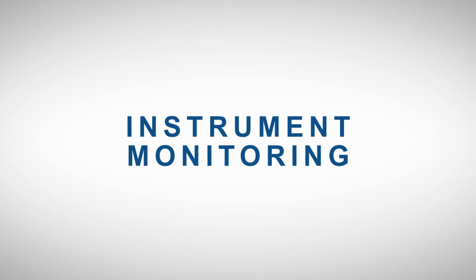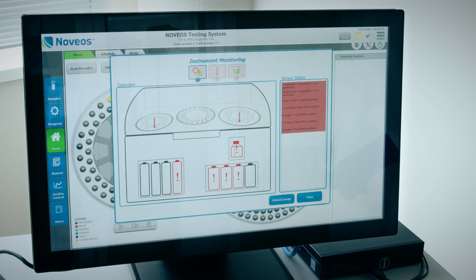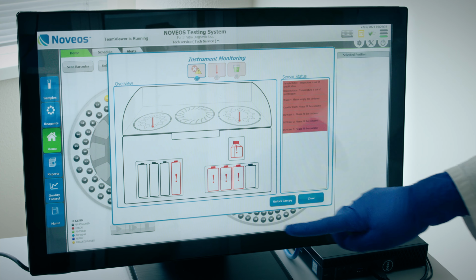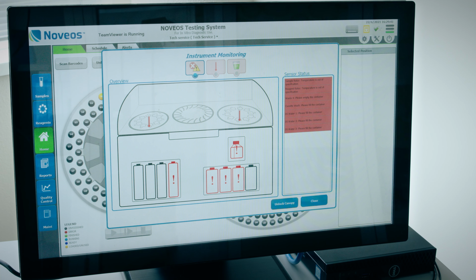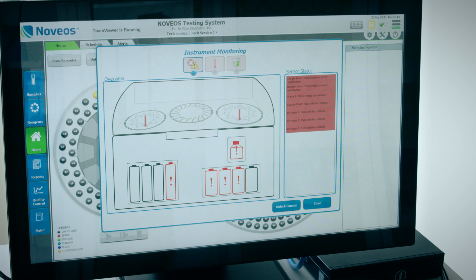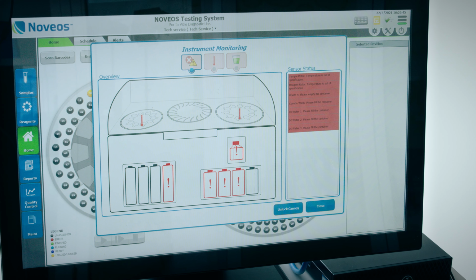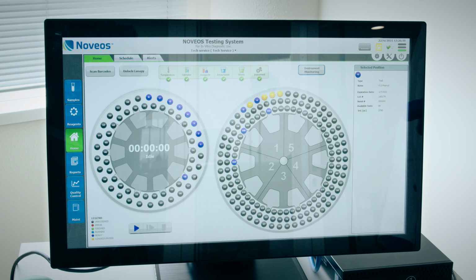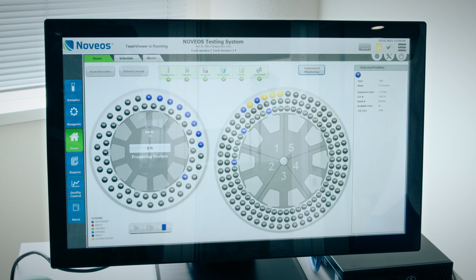Instrument monitoring. Briefly, we can see the upper and lower deck as well as the sensor status. Just like on the instrument itself, it shows the waste container on the left and the system fluids on the right. The sensor status provides information about the activities that must be performed before starting an assay. When everything has been refilled or emptied, the NOVEOS is now ready and an assay can be started.